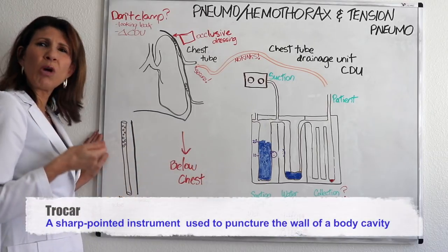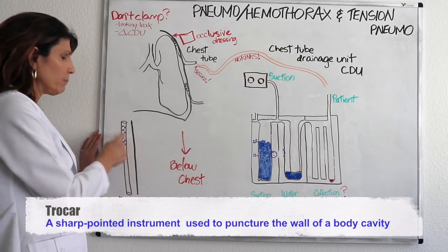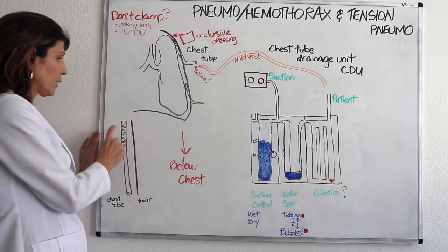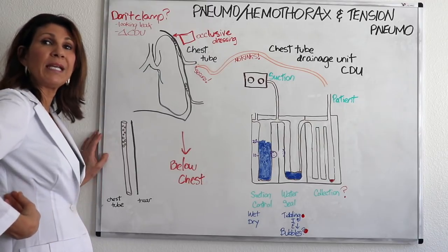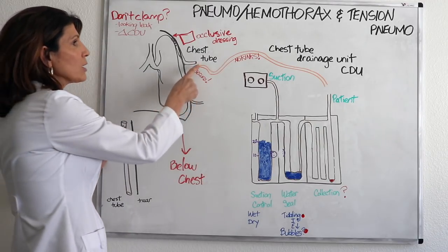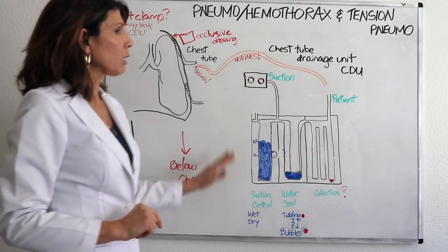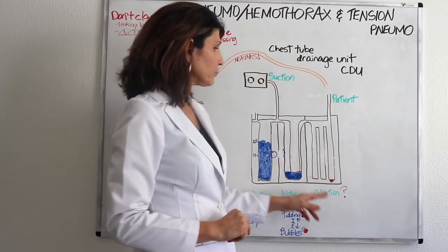This is called a trocar, and it just allows for stability of that chest tube during the insertion. And this gets removed, and the flexible chest tube stays in the pleural space attached to some tubing. What's that tubing attached to? Let's talk about the chest tube drainage unit.